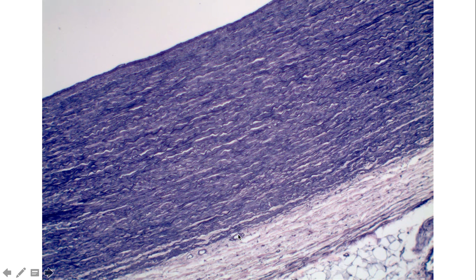That's number 4 on your lab list, the vasa vasorum. These are small vessels that supply the wall of these large arteries and veins. And so the tunica externa and the outer area of the tunica media, they're too distant from the lumen to be able to acquire the resources they need to support the cells and the tissues in this area. And so these large vessels have their own blood supply, they have their own vessels. And again, here they are.